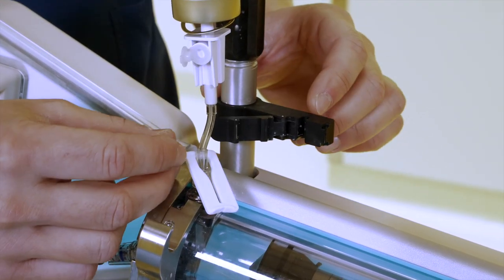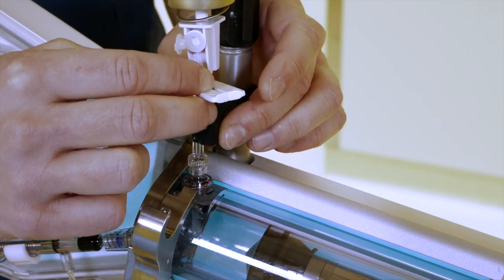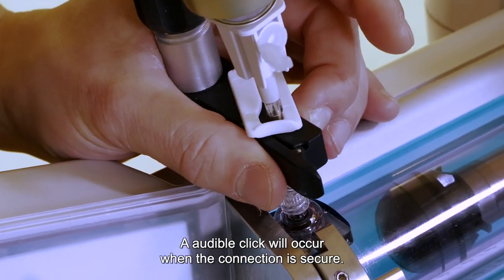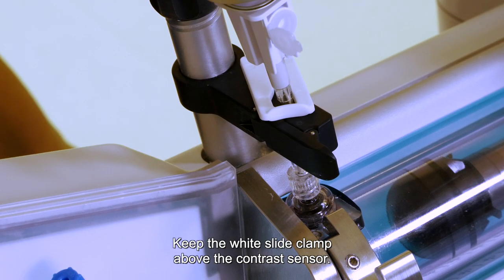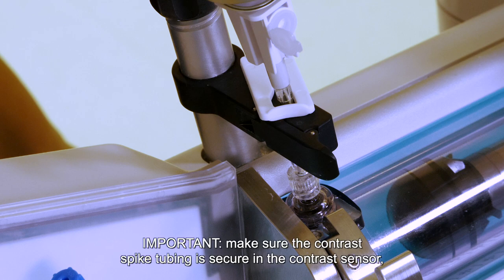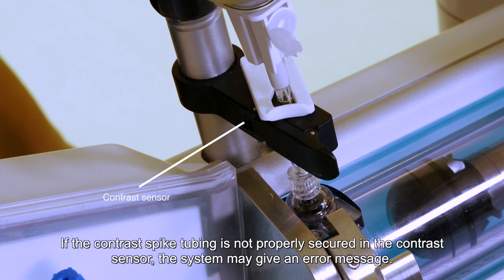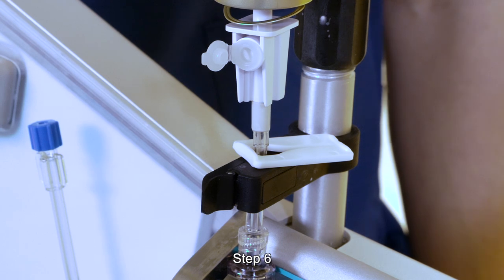Step 5. Place the tubing in the contrast sensor and close the contrast sensor latch. An audible click will occur when the connection is secure. Keep the white slide clamp above the contrast sensor. Important: make sure the contrast spike tubing is secure in the contrast sensor and that the latch on the contrast sensor is fully closed. If the contrast spike tubing is not properly secured in the contrast sensor, the system may give an error message.